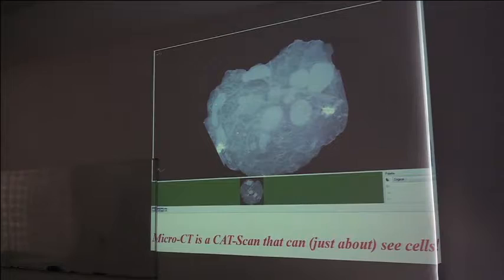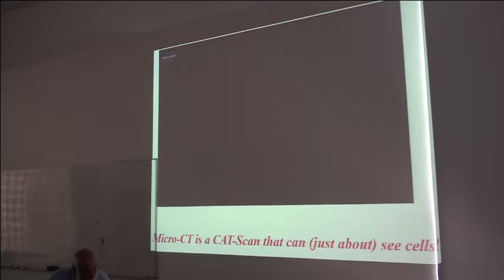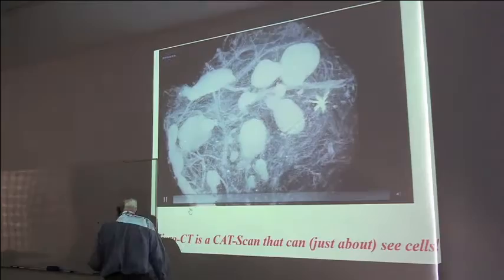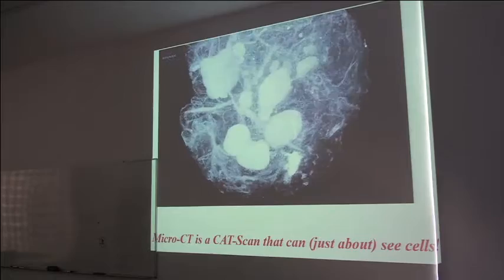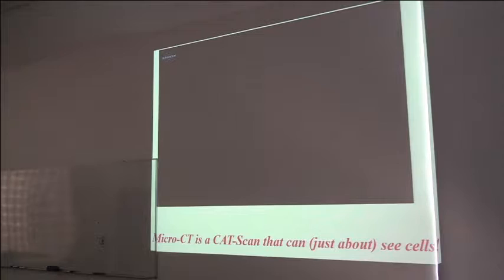This is a CAT scan of lymph nodes. In this case, this is lymph nodes taken from the axilla of a breast cancer patient. And here you can see this is rolling around. Again, no one's ever had such a high resolution picture of the lymph. You can see the blood vessels, you can see the lymph vessels, and the lymph nodes appearing just like nice, discrete little jelly beans in space. Now, it's not really necessary. Is anyone here a doctor? This is something the docs are interested in, which is finding lymph nodes.